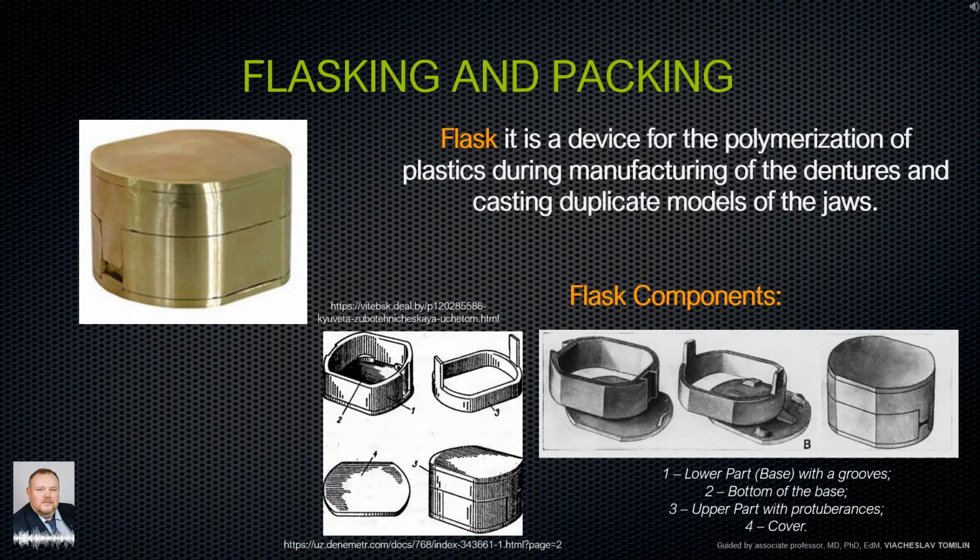Flasking and packing. A flask is a device for the polymerization of plastics during manufacturing of the dentures and casting duplicate models of the jaws. Flask components. 1. Lower part, base, with grooves. 2. Bottom of the base. 3. Upper part with protuberances. 4. Cover.